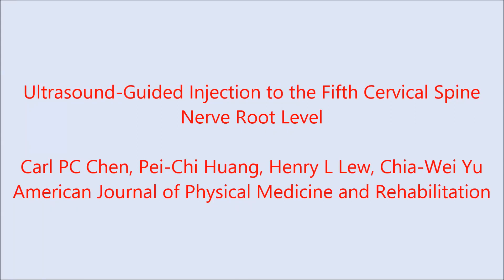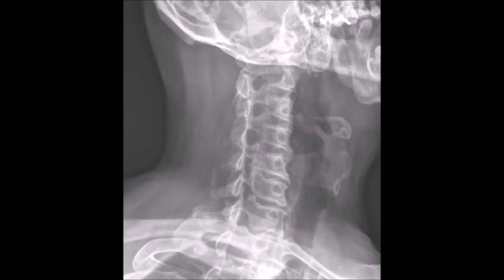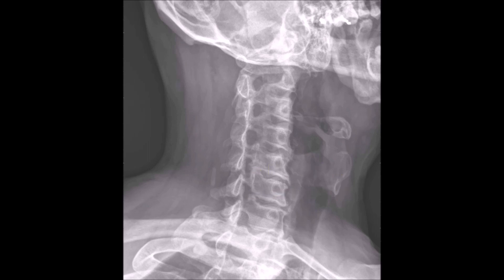This video will demonstrate the technique of cervical spine ultrasound-guided selective nerve root block. A patient with narrowed right cervical spine fifth neuroforamen, as seen by this x-ray, and with radicular symptoms to the right upper extremity, received ultrasound-guided injection to the fifth nerve root.